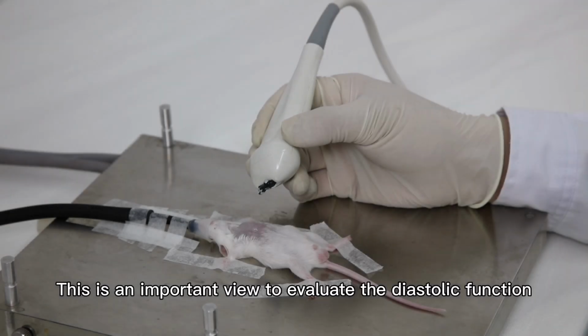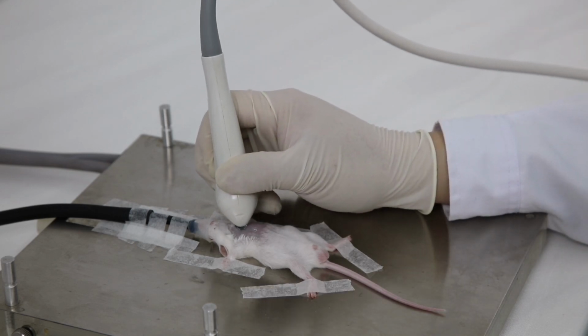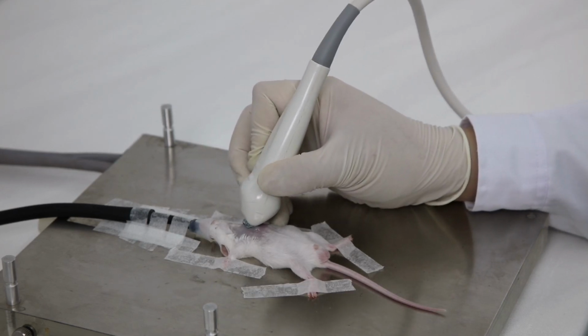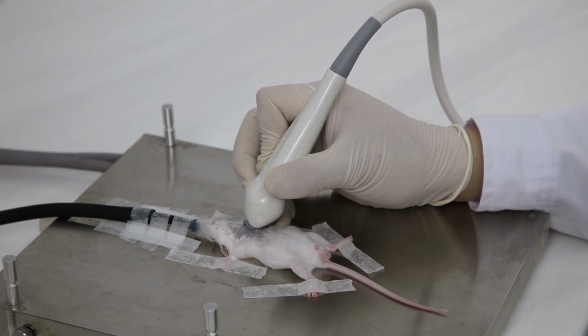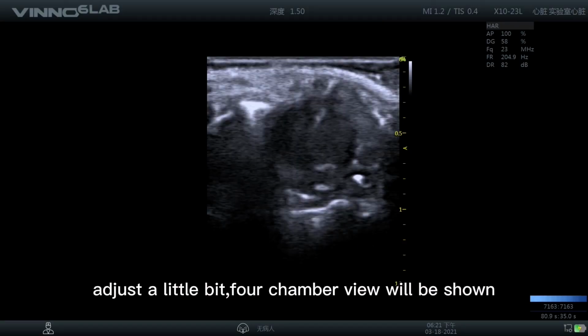4-chamber view. This is an important view to evaluate the diastolic function. Based on the short axis view, the mark points to 3 o'clock. Slide the probe along the long axis of the heart, with 30 to 45 degrees between the probe and the rat. Adjust a little bit. The 4-chamber view will be shown.